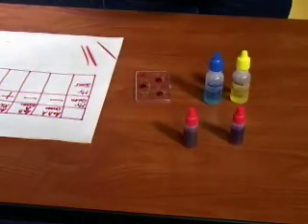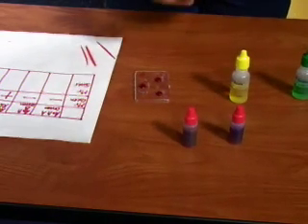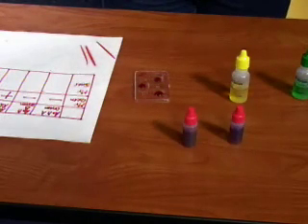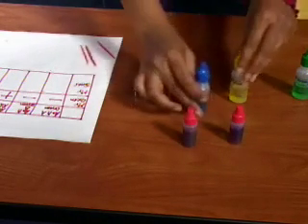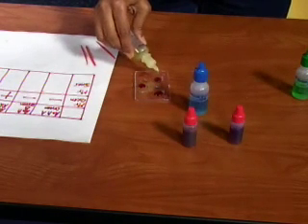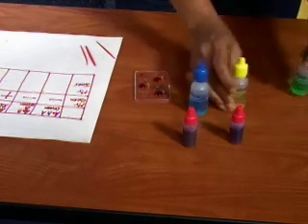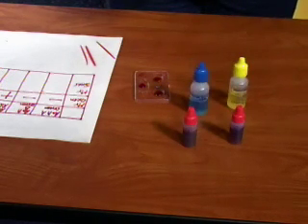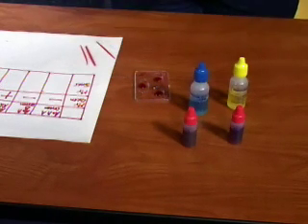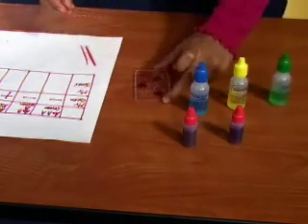And we put anti-A serum, anti-B serum, and anti-RH. Again I mix them.